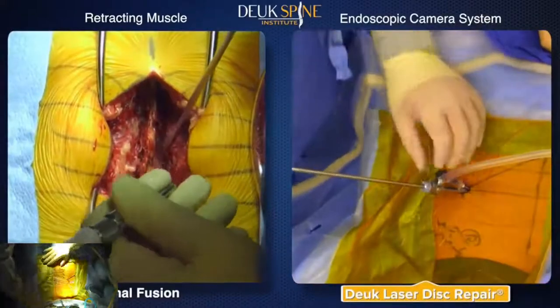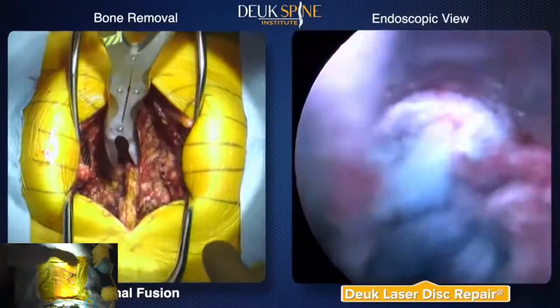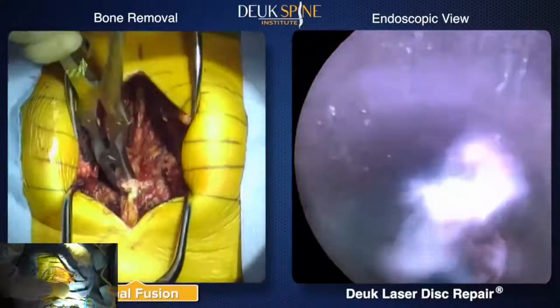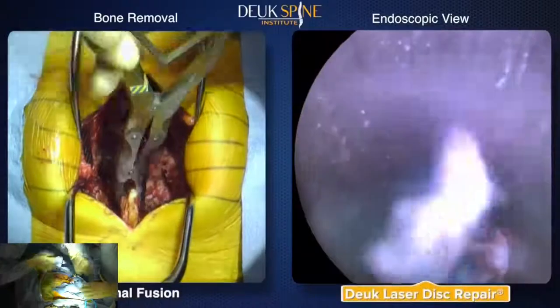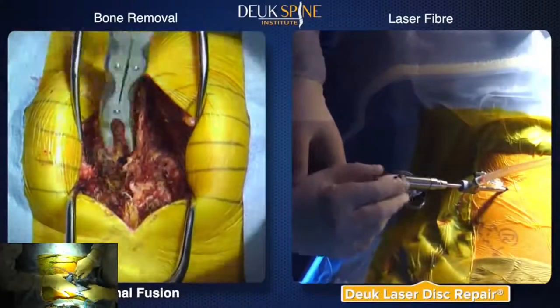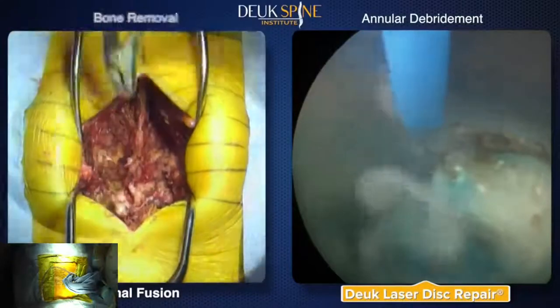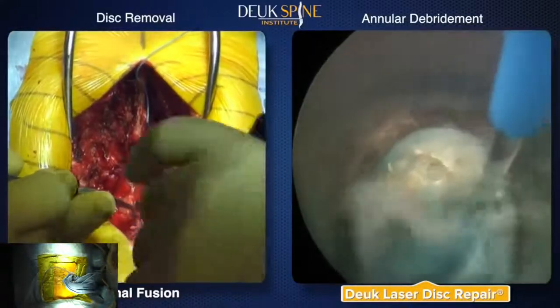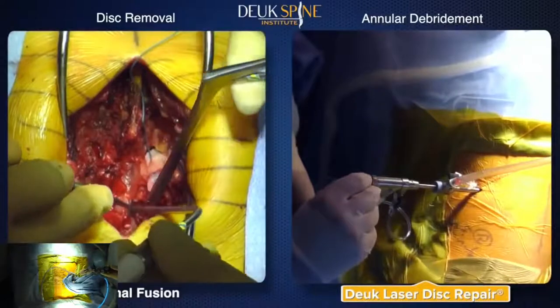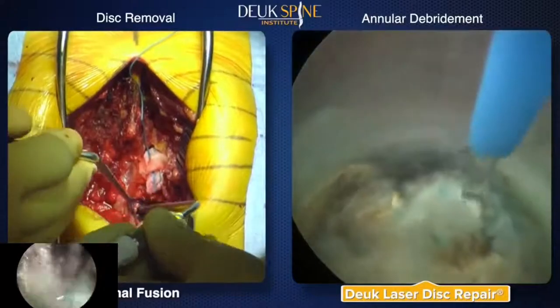The endoscope camera is inserted into the tubular retractor to allow the surgeon to guide the laser inside each symptomatic disc. To accommodate the fusion hardware, a large bone grabber is used to perform a laminectomy by removing bone from the spine. The fiber optic laser used in the Deuk laser disc repair is manipulated with great accuracy to remove only painful inflammatory tissue from the disc. In this highly magnified view, the laser is used to precisely remove damaged disc material that is causing the pain. The laser is debriding, or essentially vaporizing, damaged tissue in the disc's outer layer, or annulus, specifically at the annular tear, the source of the rupture or herniation and pain.